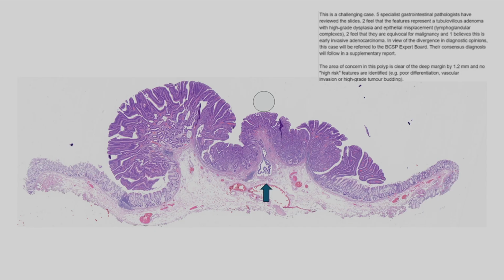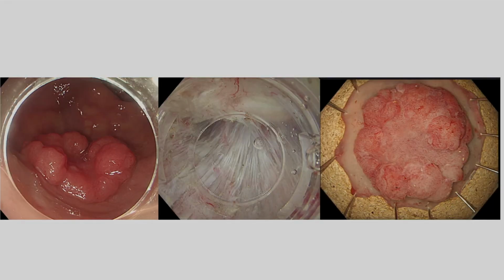Just because the submucosa lifted well, I went ahead with ESD. Otherwise, the plan was EID. Probably EID would have been better. That's my hands up. Let's move on to the next slide.